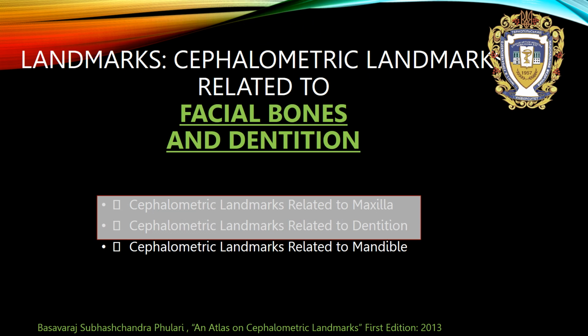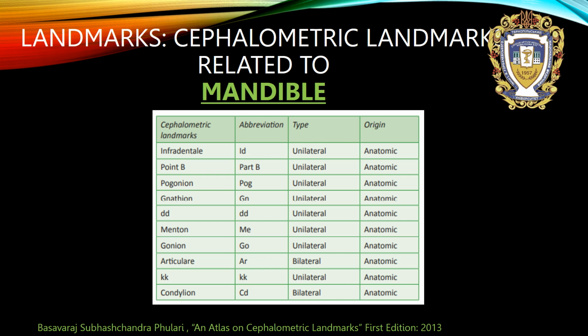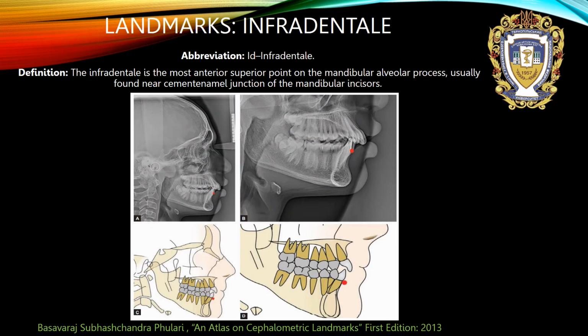And cephalometric landmarks related to the mandible. On the mandible, there are many different points, and the most important are next.